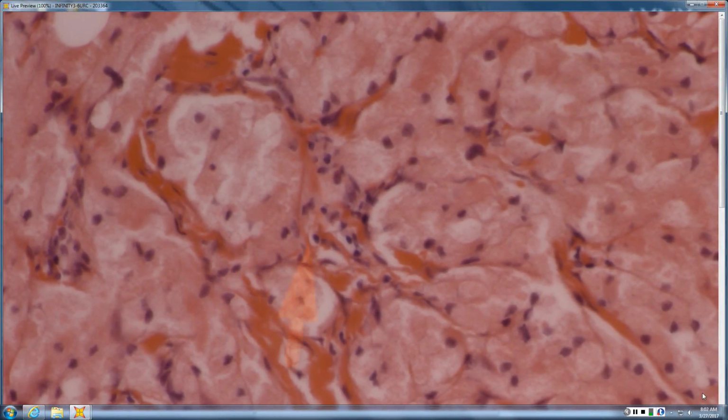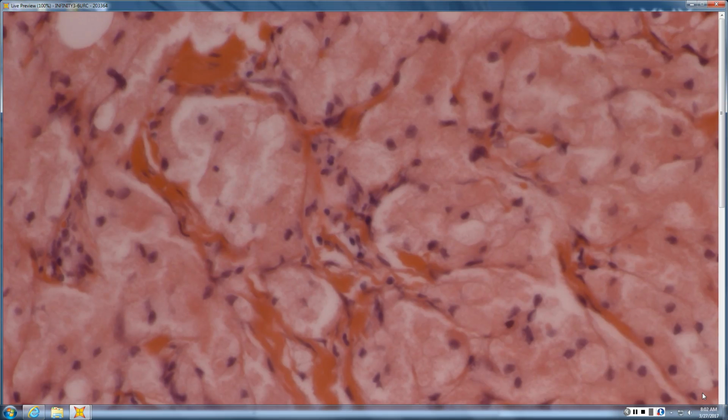One might even say granular. Granular cell tumor. Do you see giant lysosomal granules? I don't. How about that round thing at the tip of the arrow sitting in a vacuole? Yeah. There, very subtly, and here. So they don't pop quite like the ones in the last case, but they're present, which would lead you to probably a neural granular cell tumor rather than a non-neural one.